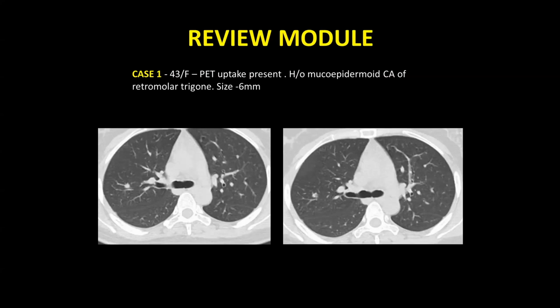Small cell carcinoma, yes, you can raise the possibility. Squamous also you could. Small cell lymphoma, such things we definitely can raise the possibility. But within adenocarcinoma, it is difficult to say. It's okay to say, but finally, definitely, we need the histopathology.